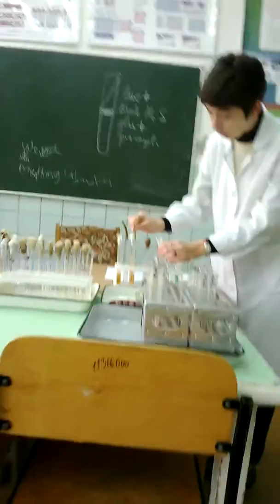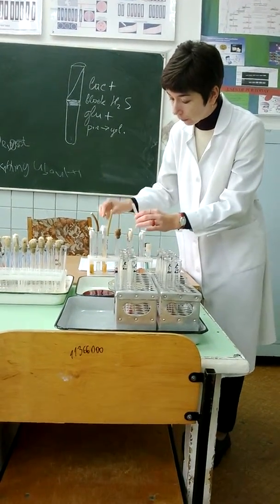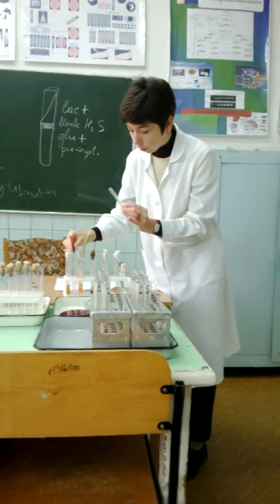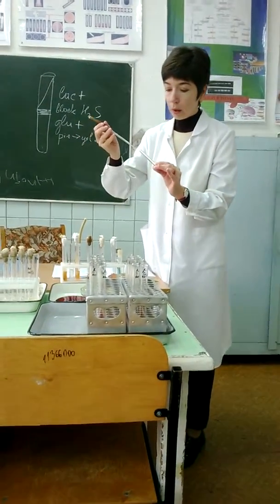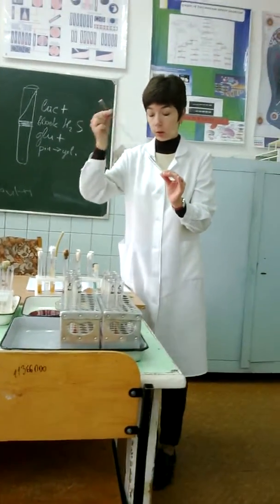0.3, 0.5. Then, on the top, we add tissue extract in which antigens may be present. Very slowly.